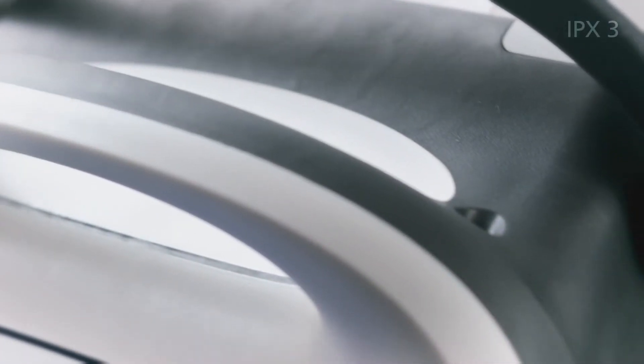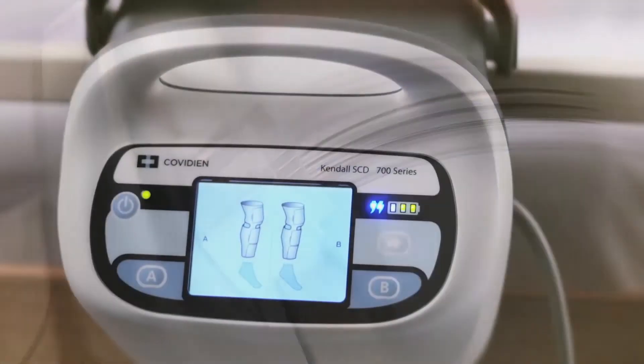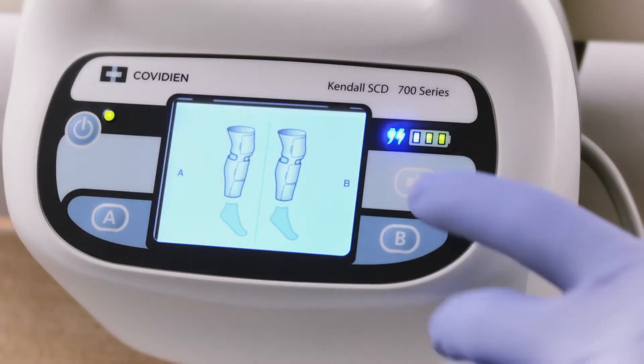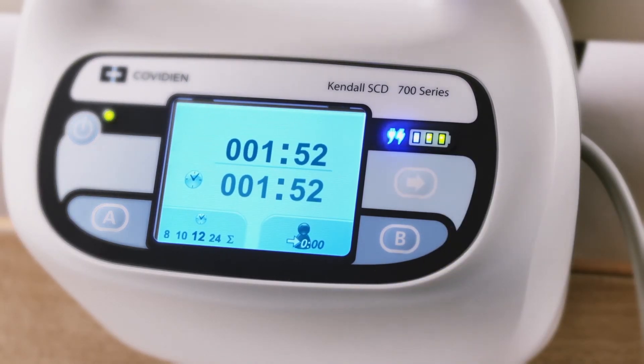An IPX3 rating ensures a more durable device, less prone to liquid ingress, while a reduced noise output is sure to keep nurses and patients happy. The device also has a compliance meter with patient sensing technology, allowing clinicians to track the patient's true wear time.